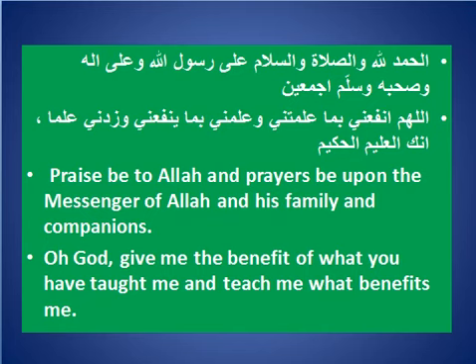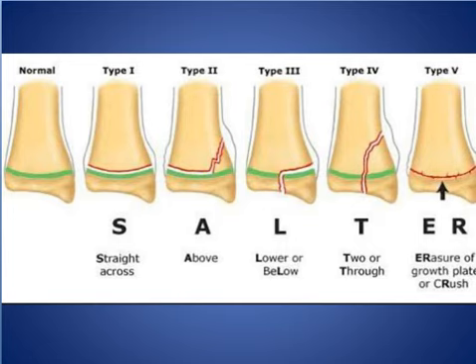My topic today is about imaging approach to childhood fracture, and I will discuss in this short talk the Salter-Harris classification with some examples. The Salter-Harris classification has 5 types of fracture.